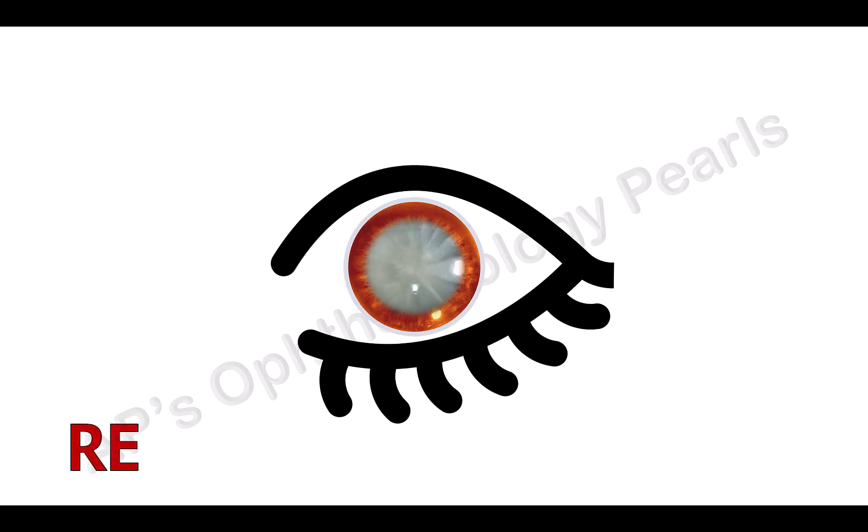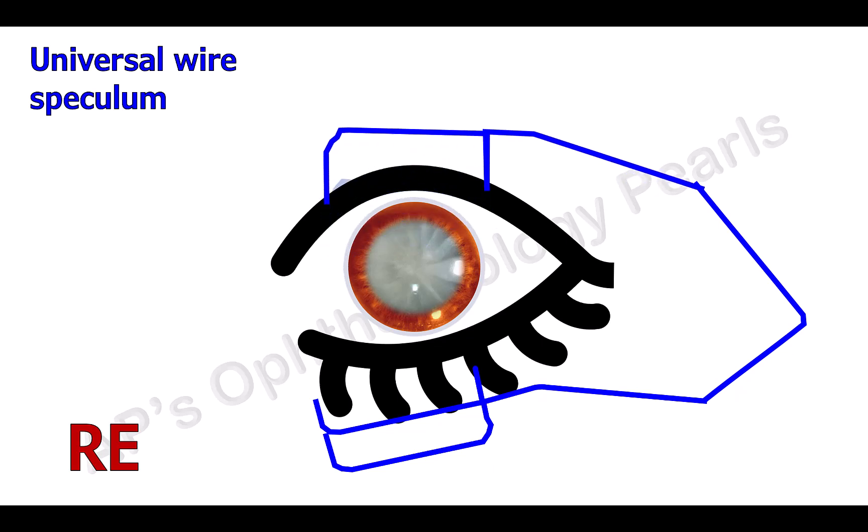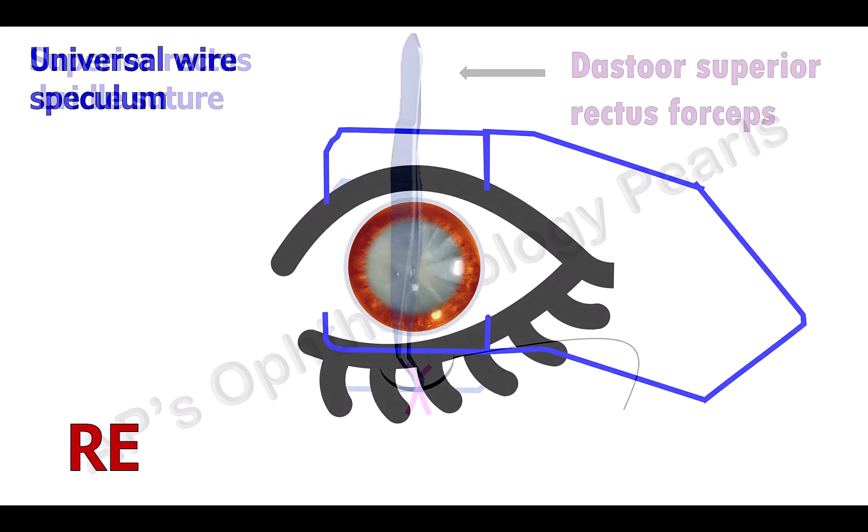Since the surgeon operates from the head end of the patient, this is the superior aspect and this is the inferior aspect. After anesthesia and prepping, a universal wire speculum is inserted to keep the eyelids apart to allow easy exposure for the surgery. It is called universal because it may be used for both the right and left eyes.